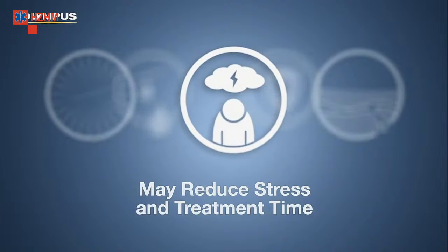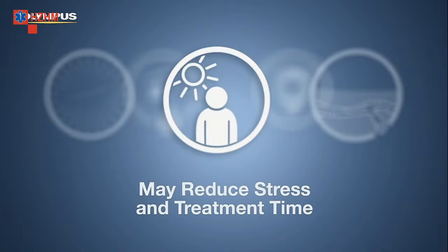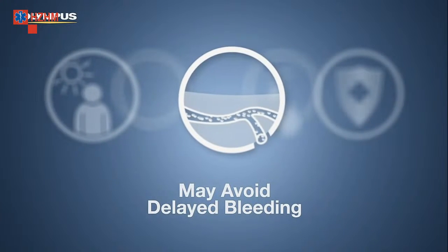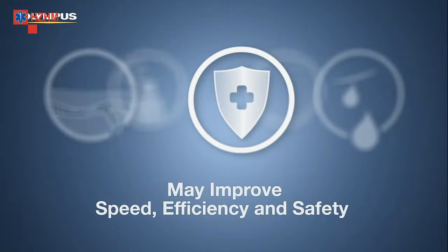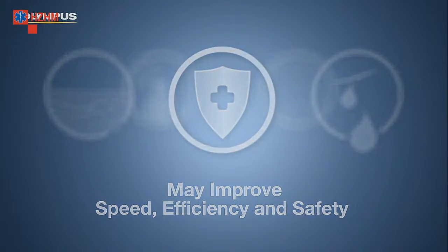Therefore, RDI helps to reduce stress and procedure time for treatment of emergency bleedings and endoscopic resections. RDI aims to help to avoid delayed bleeding after EMR or ESD. RDI may improve speed, efficiency, and safety of endoscopic treatment.